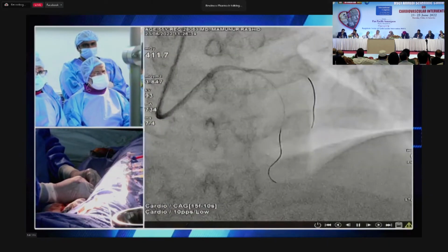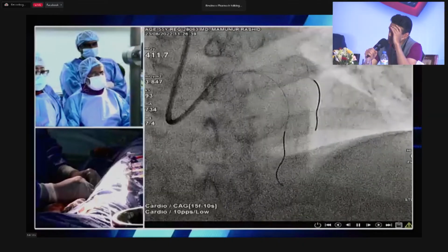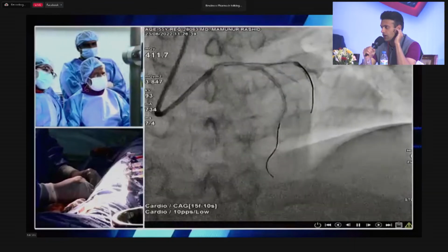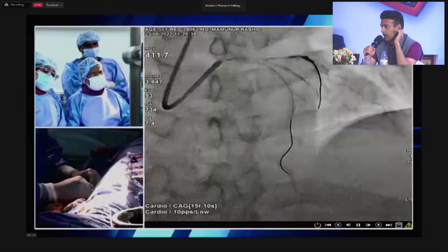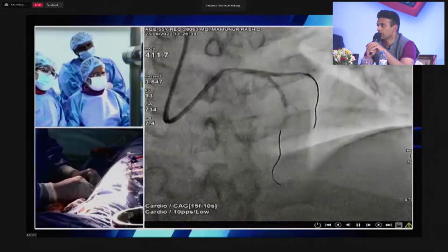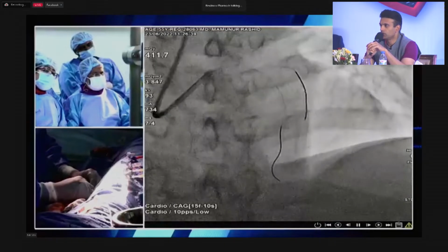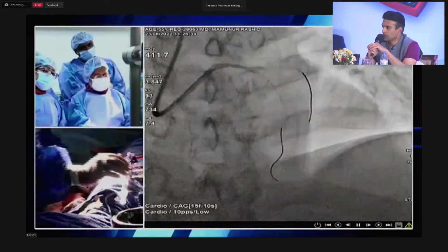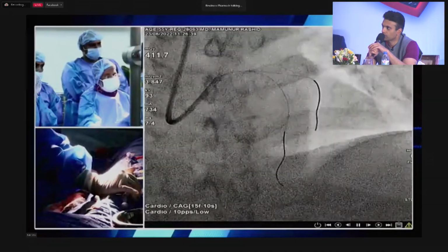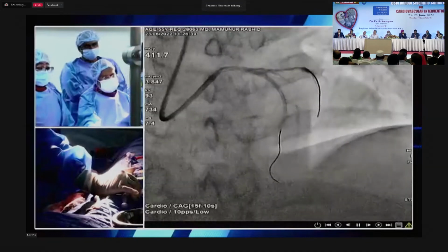So the case is largely an acute lesion with proximal LAD, ostial LAD involvement, and some disease in the left main. No major disease at the ostium of the circumflex, but with some circumferential plaque. So this is a left main bifurcation PCI ultimately, because you're going to end up stenting back from the LAD to the left main. The decision of strategy comes down to, one, whether or not there's disease at the side branch, and two, whether or not the disease at the side branch meets criteria for a complex bifurcation. In this case, clearly it doesn't, because there's a well-maintained lumen at the ostium of the circumflex.